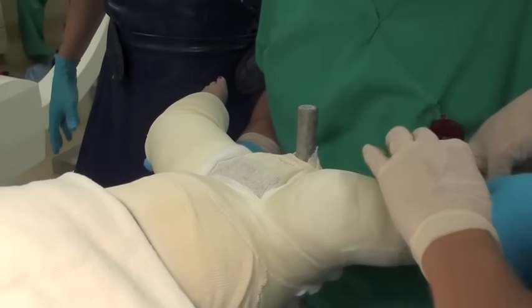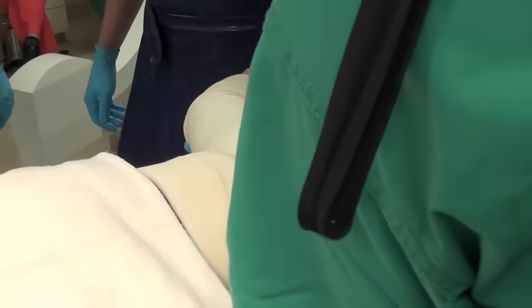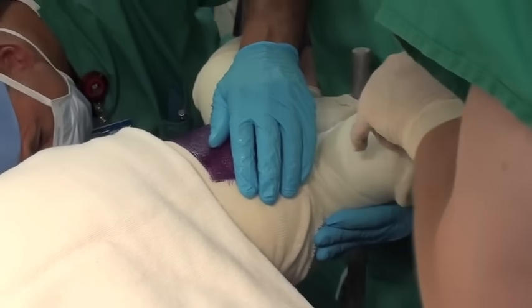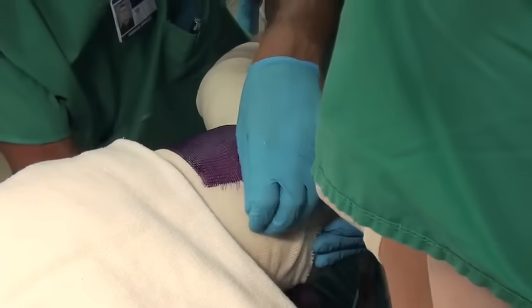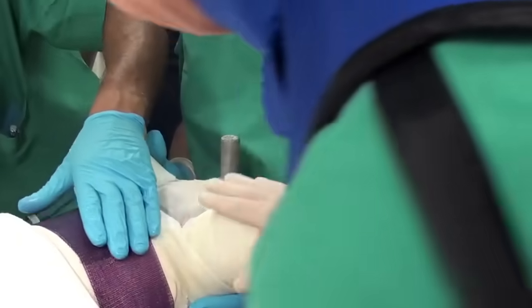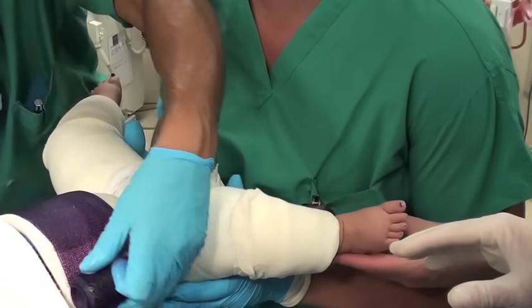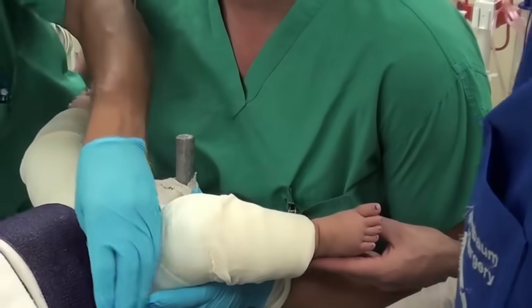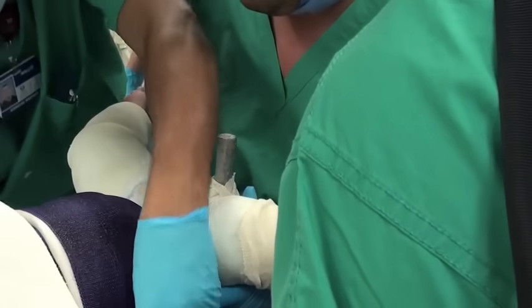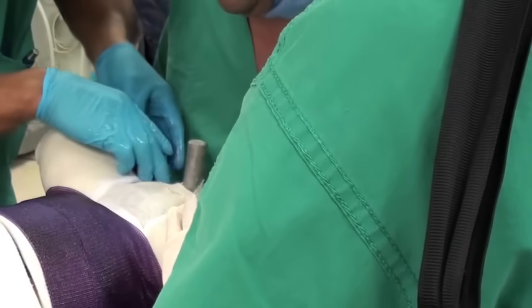The surgeon is still holding the legs in the best position. After the first layers are applied, a colored layer can be applied. This is still fiberglass, but different colors can sometimes be used. Some physicians prefer plaster instead of fiberglass, so there are a lot of different ways to put this cast on, and different ways to hold the hip in position.